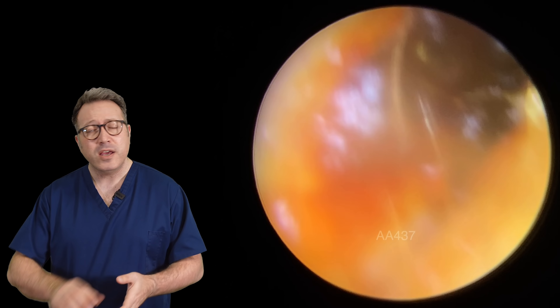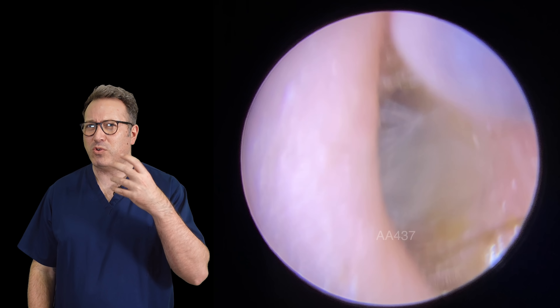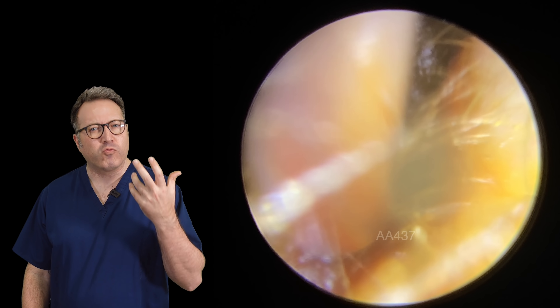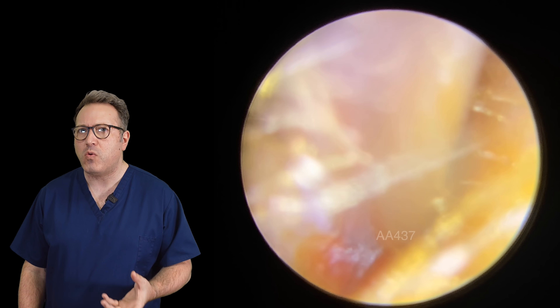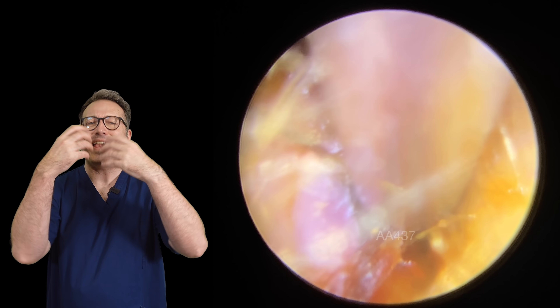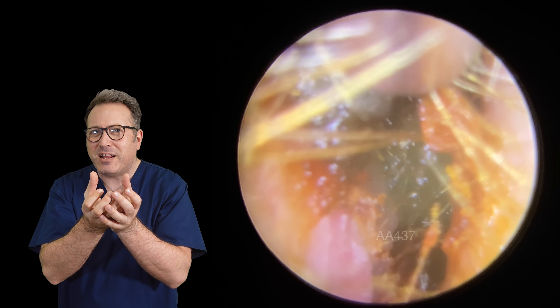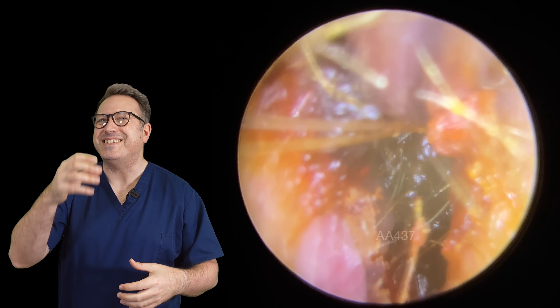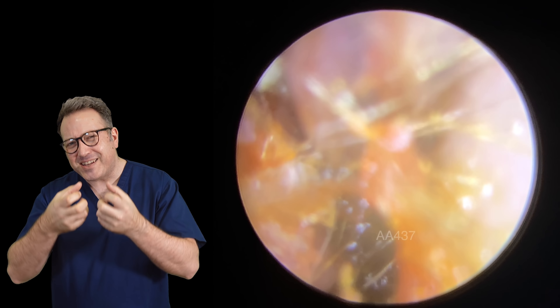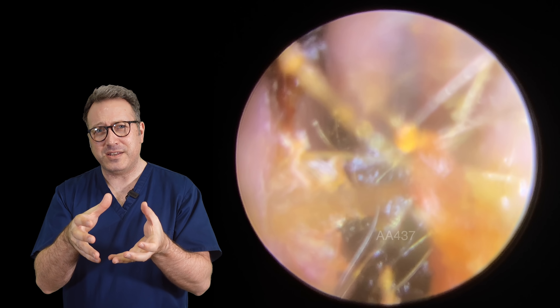This is the second patient in the compilation — a lovely gent who came through feeling very blocked up. This had been going on for quite a few months. Unfortunately this was a really stubborn piece of wax that did not want to come out without a fight. The patient has this really hairy, dense cilia around the outside edge of the ear canal. Very dark wax, with a really awkward consistency — this kind of clay, thick, sticky consistency. Imagine playdough but much stickier.